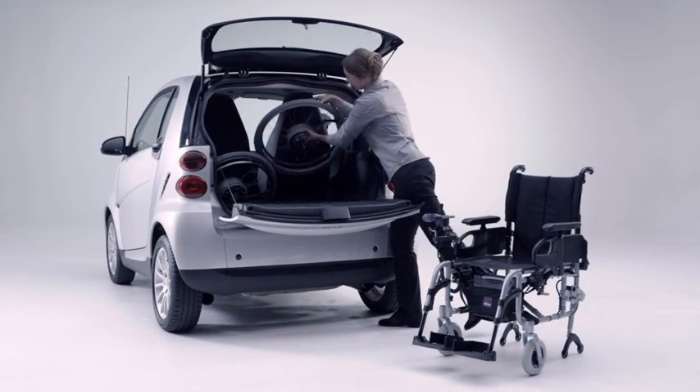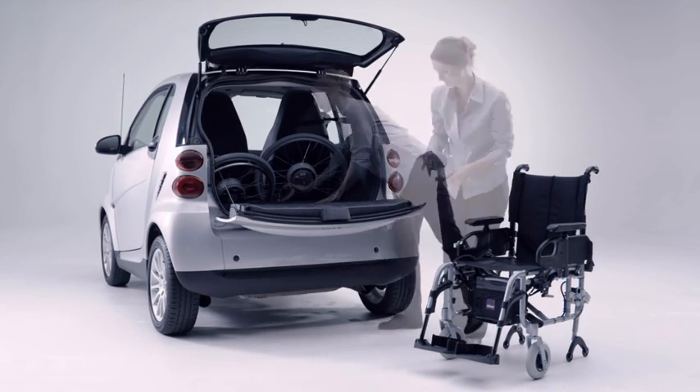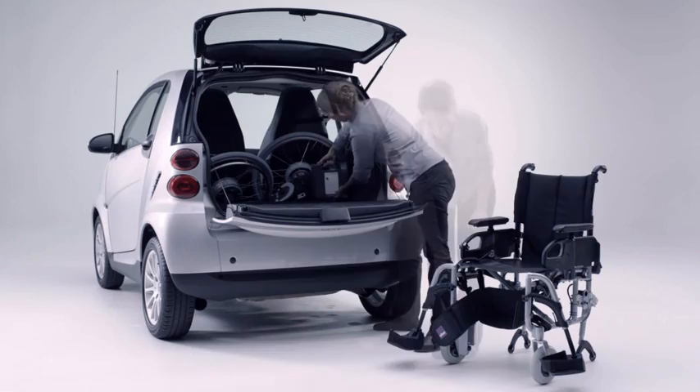eFix turns your wheelchair into the ideal travelling companion. The components are light and compact, making them easy to transport in the car. The battery weighs only 9kg and is maintenance free.